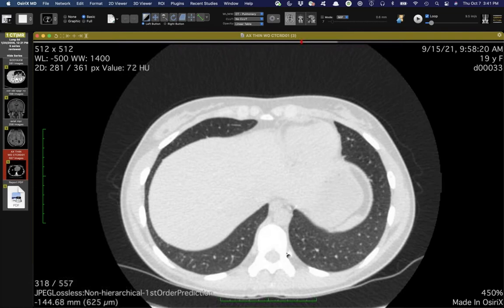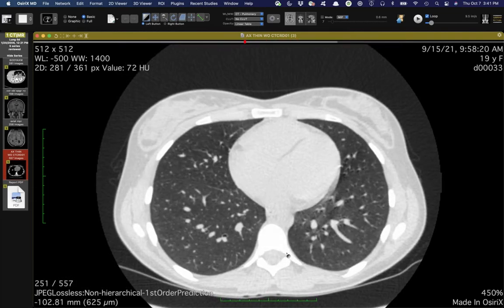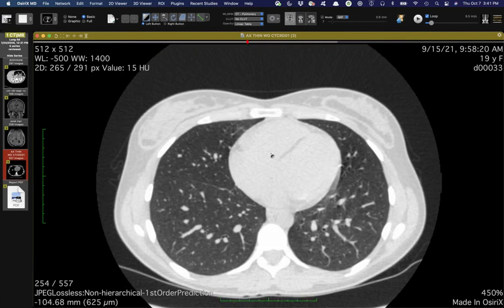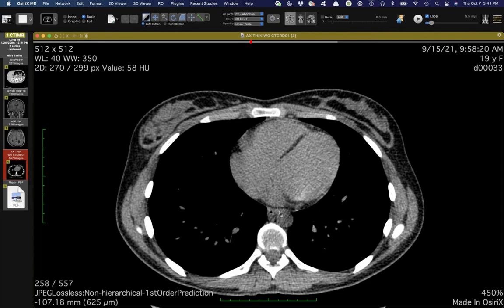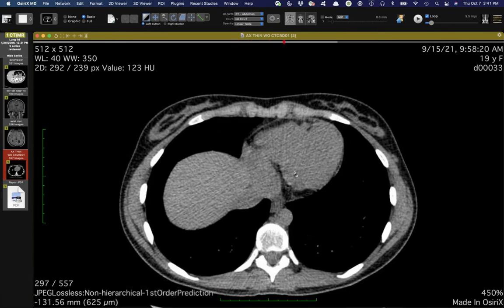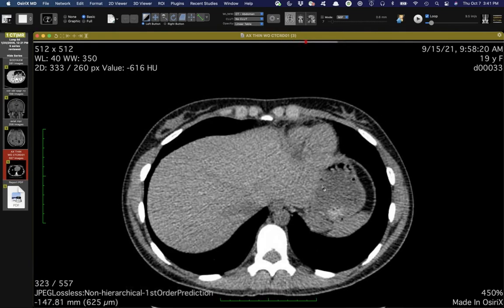Reading this out with the resident, they're not too impressed about the diagnosis of tuberous sclerosis. But of course, there are a lot of other manifestations that we can and should look for. You can even see one of them here on the soft tissue windows. This is some of the more impressive intramyocardial fatty foci that I've seen. She has some in the septum, some along the inferior wall of the left ventricle as well.